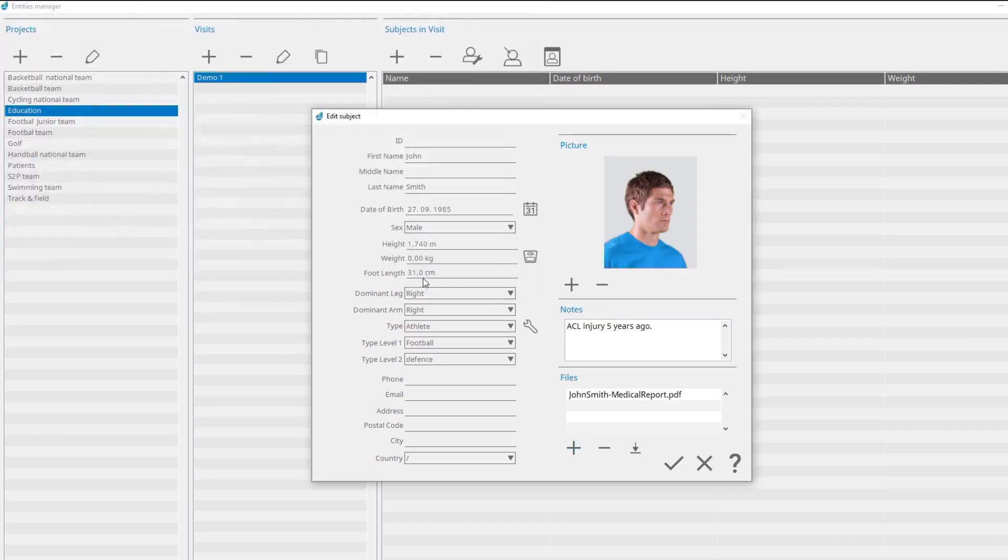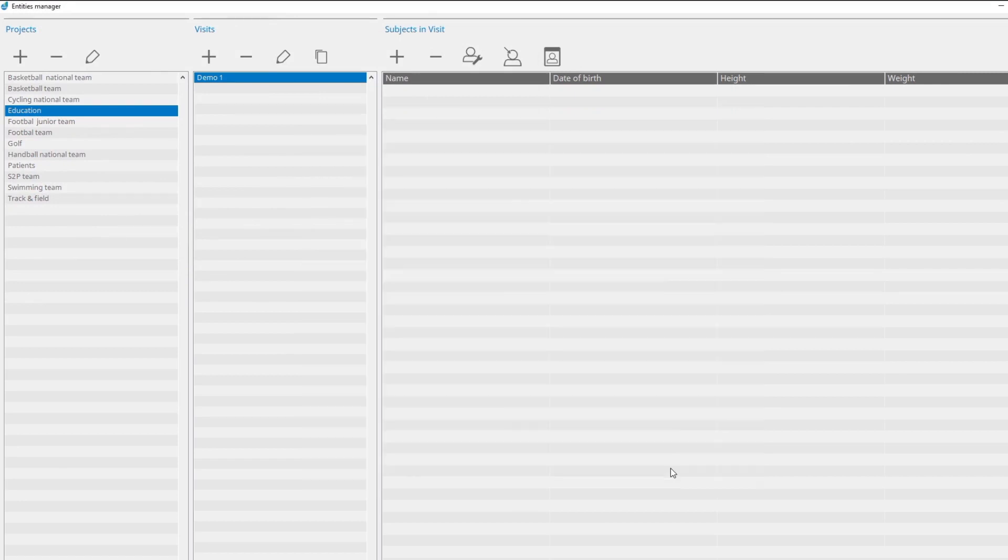When you are done, confirm the changes with the Confirm button. The project, visit, and subject can be deleted by clicking on the Remove button.